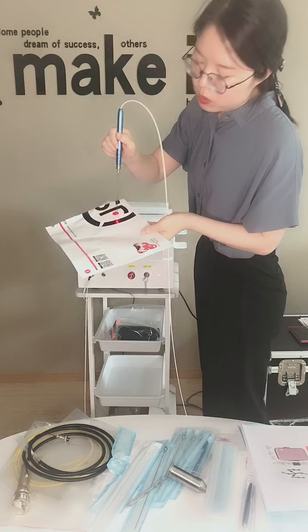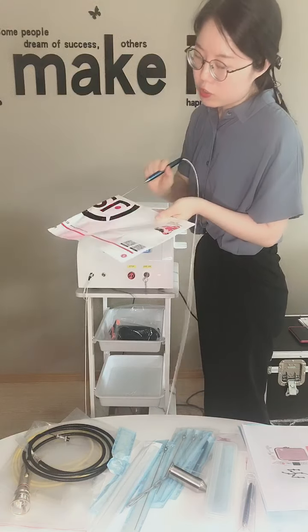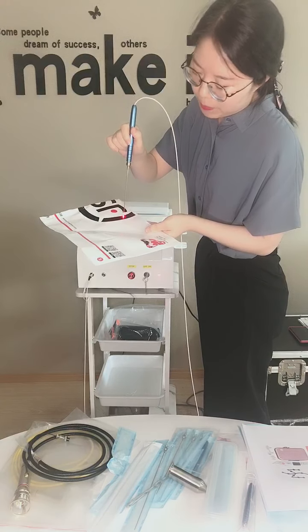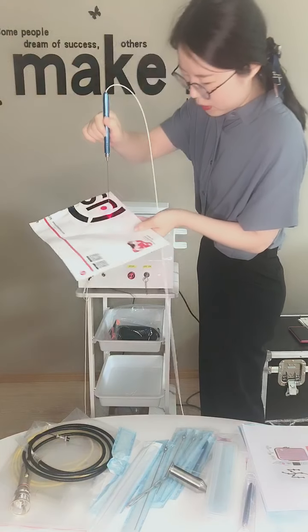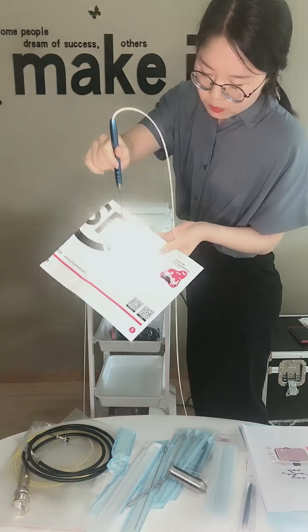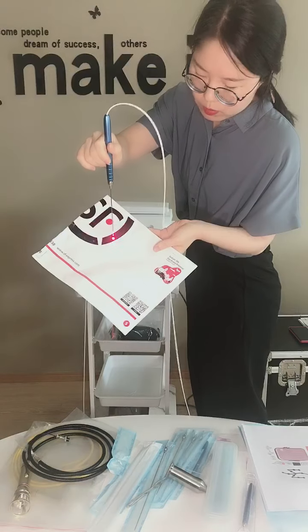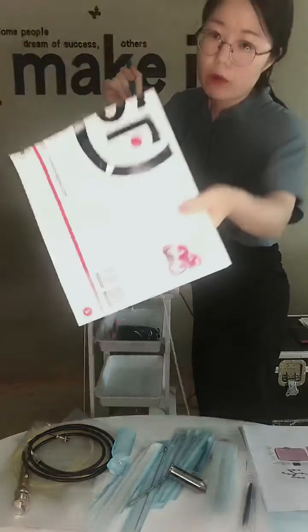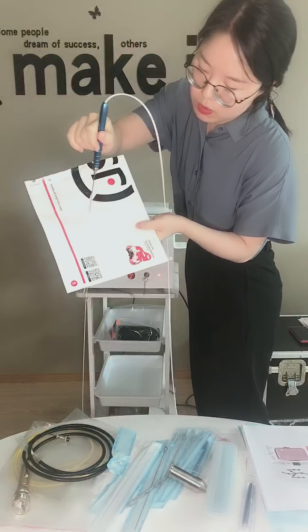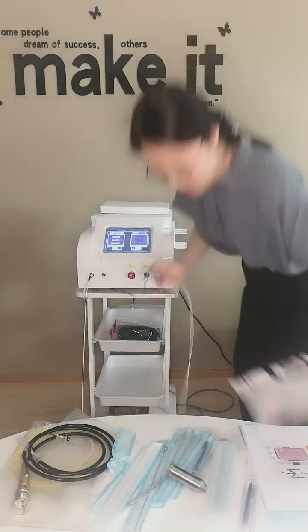This is used to show you where the fiber is in your body, so you will know how many centimeters you get into the body. So it's just an indicator. And now I will step on the first switch, and you can see here, smoking. Very high energy on the laser machine. You see, it's very easy. These are very hot, you see here. And even if we put it on here, it's easy too. You see here, very high energy.